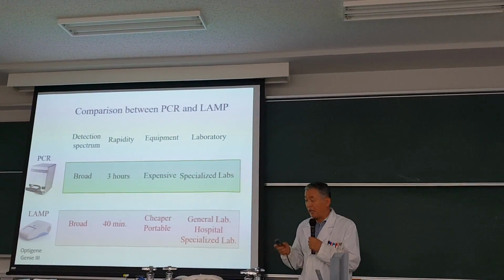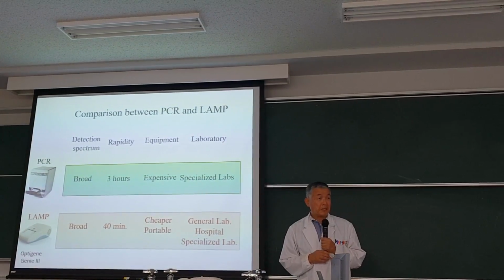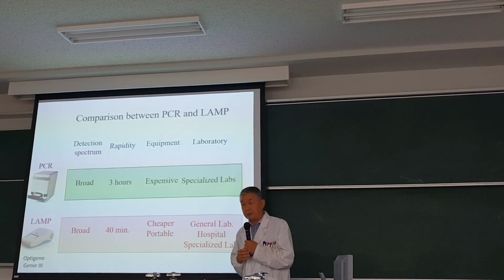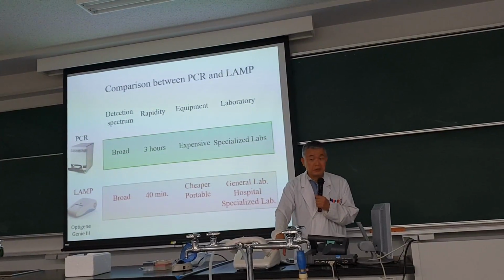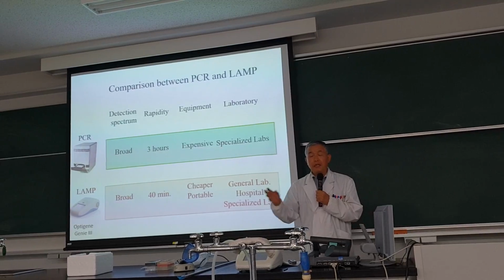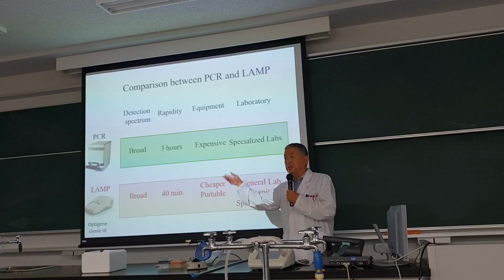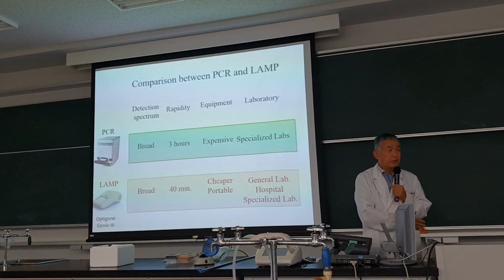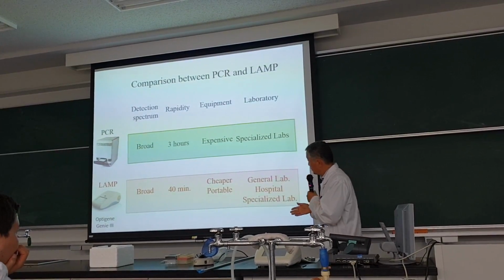And that machine was used in Africa for Ebola diagnosis at the time of the Ebola outbreak 3 or 5 years ago, right? At the time, this kind of machine was used for diagnosis. The result of the analysis data was transferred directly to the center of the ministry to control efficiently. Okay, this system is sometimes useful in the veterinary field.